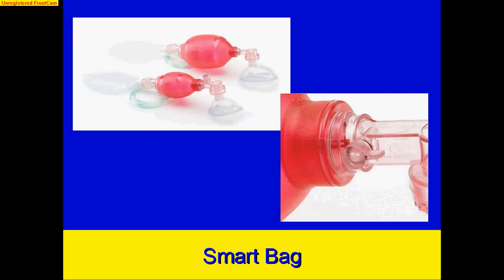You'll see some of these smart bags, they're called, bag valve mask, moving into practice very soon. They're visually different from our current Ambu bags in that the smart bag is red. What the smart bag does is it helps you get proper pressure. It keeps you from exerting too much pressure. Now there's pop-off valves on the Ambu bags, and that's a different thing. That is when volume has become a problem, but the smart bag really helps you to give a smooth, low-pressure ventilation. And once you have one in your hand and you play with it a couple of times, it's very intuitive and becomes immediately obvious how it works.